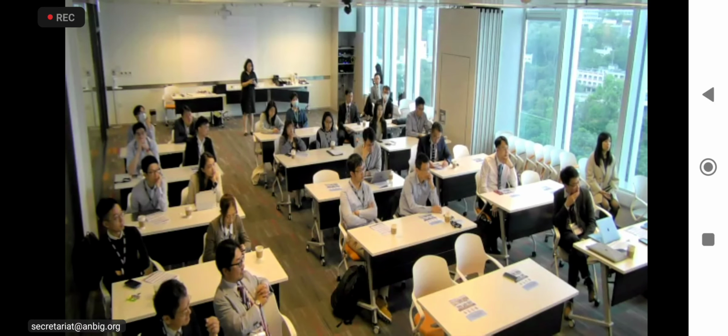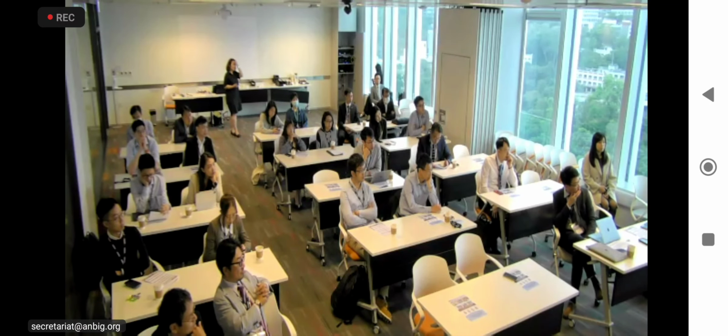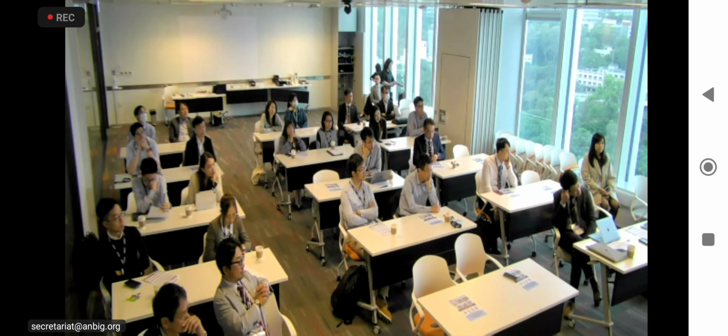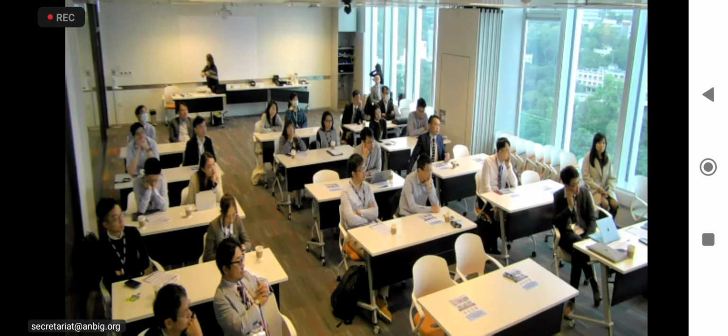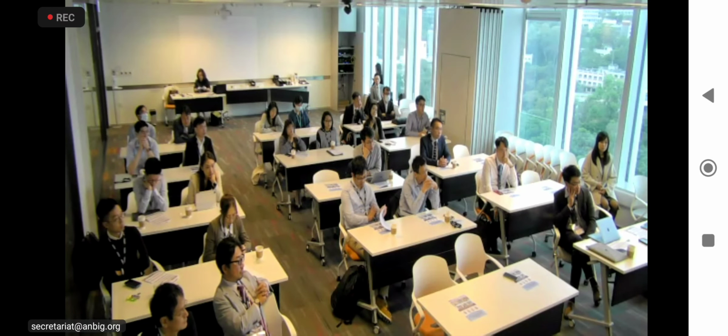Thank you, Dr. Uedo. I think he's brought up 2 points that are very important. So in every AI study, according to the SPIRIT-AI consensus, we are supposed to report the technical aspect and the operational environment. And I think Louis and myself, we do AI studies, and I think we are guilty of not reporting fully the technical aspect. So we're supposed to give a detailed description of how it was trained. And sometimes when we validate commercial systems, we ourselves don't know how it was trained. So we don't know at that point what it was trained on and whether there will be updates. So that's number one. Number two is that we're supposed to specify the operational environment, meaning how it was deployed.